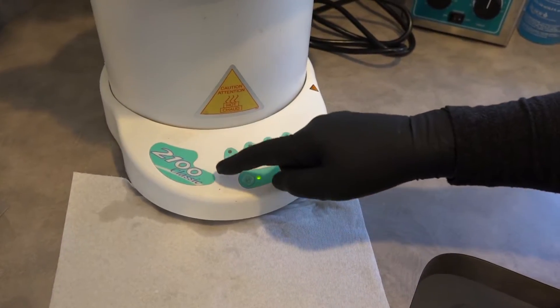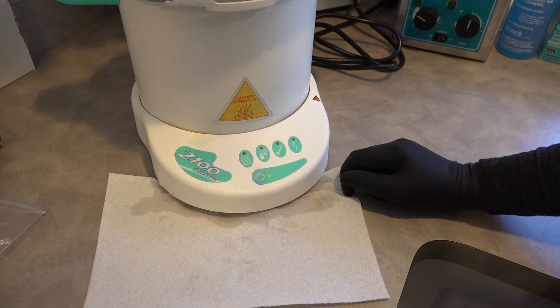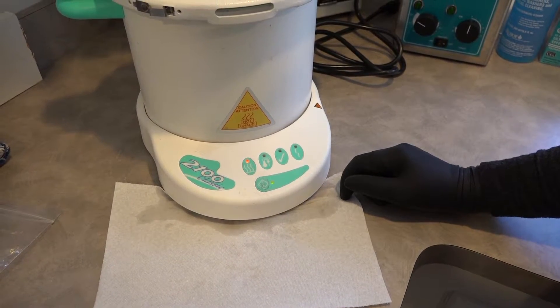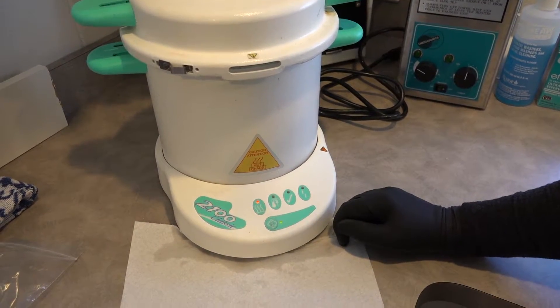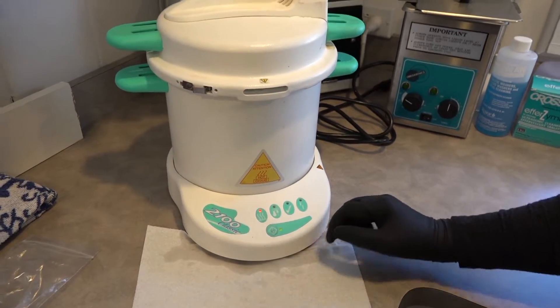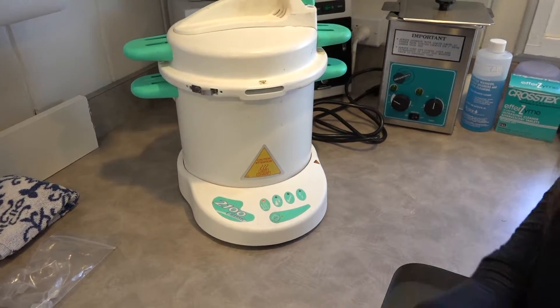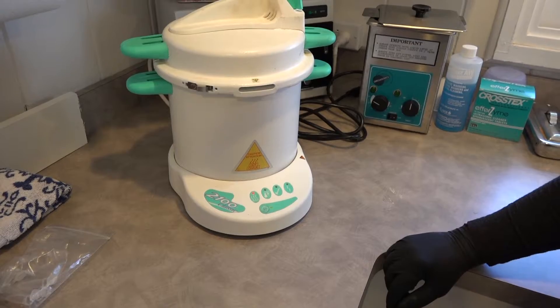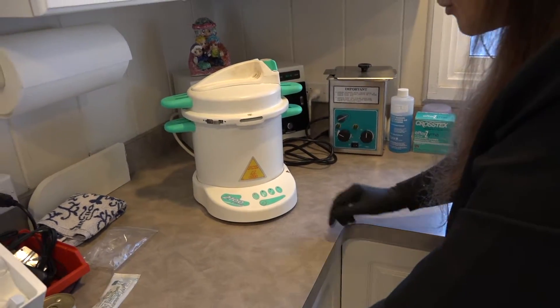This particular Prestige Classic 2100 I've had for many, many years — it's a workhorse. I have it tested every three months for spore testing to make sure everything is getting killed — not only bacteria and viruses, but spores. Those are the hardest, tough-walled things to kill.